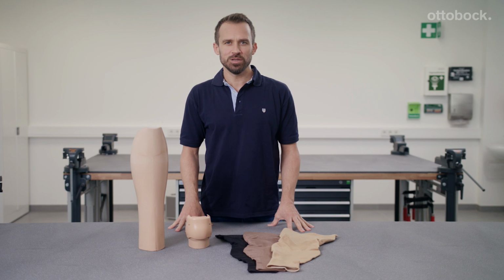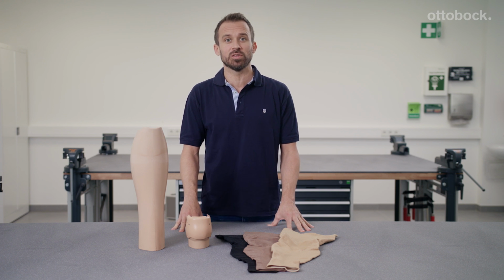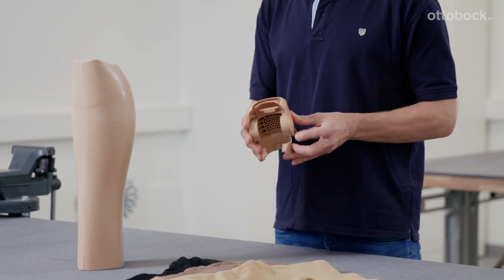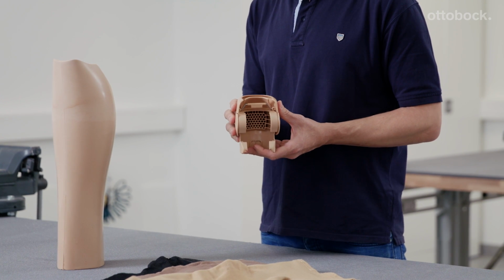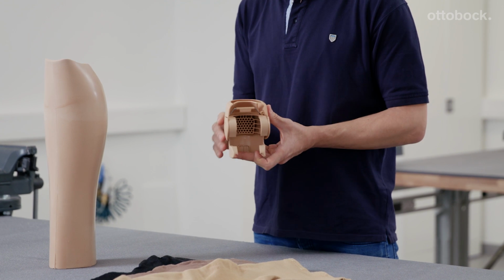A functional knee part that fits properly is of crucial importance to the success of the functional Cosmesis. It's key that the metal bracket is in the proper position. The curve of the metal bracket must always face upwards, and the plastic part mounted on the bracket must face downwards, like this.